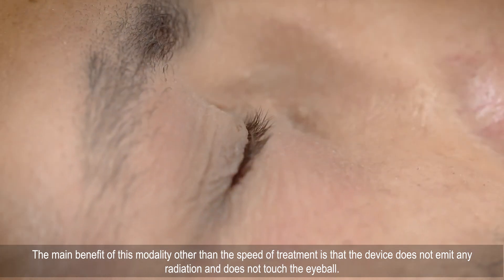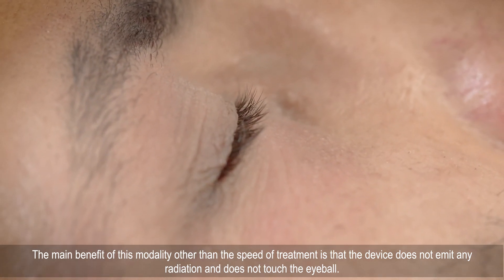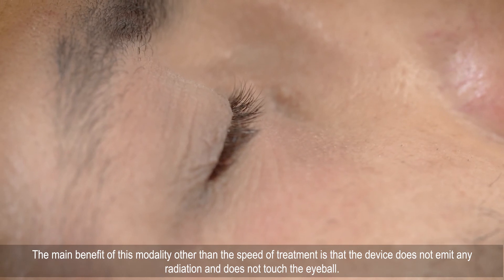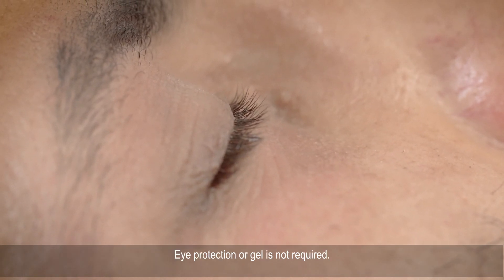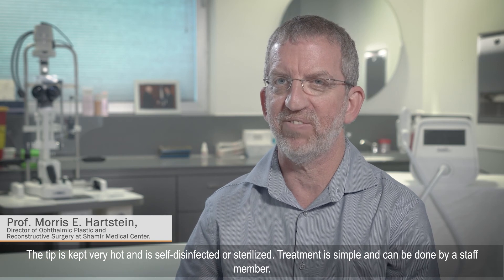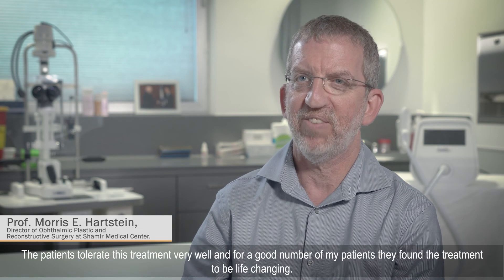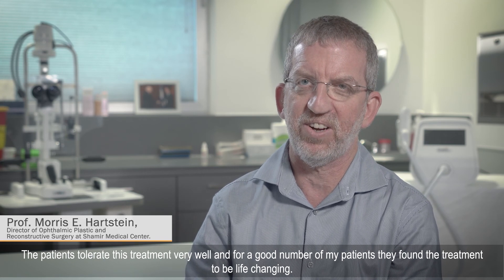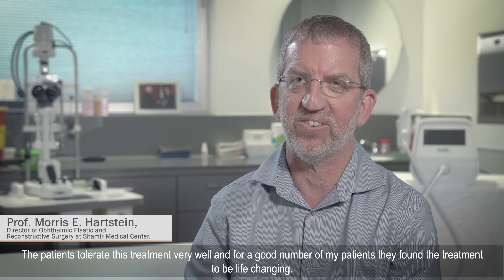The main benefit of this modality, other than the speed of treatment, is that the device does not emit any radiation and does not touch the eyeball. Eye protection or gel is not required. The tip is kept very hot and is self-disinfected or sterilized. Treatment is simple and can be done by a staff member. The patients tolerate this treatment very well and for a good number of my patients, they found the treatment to be life changing.